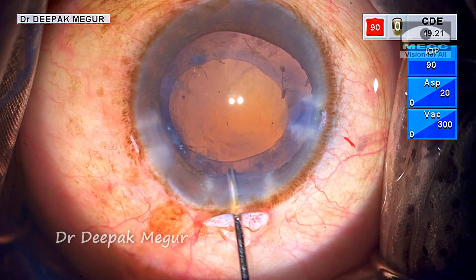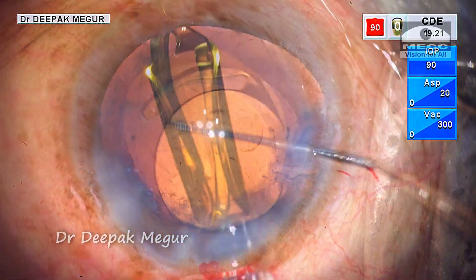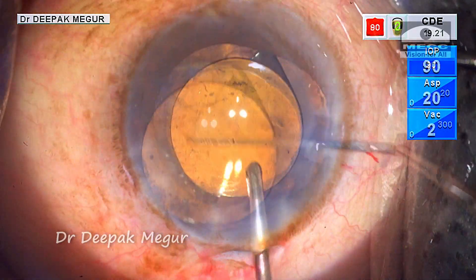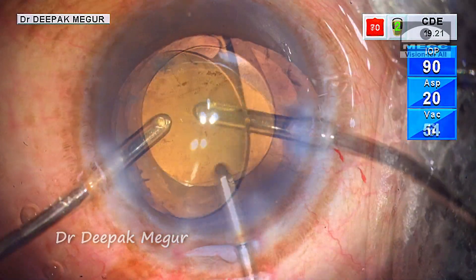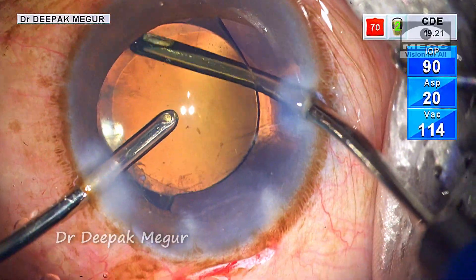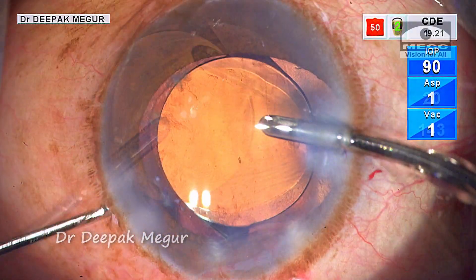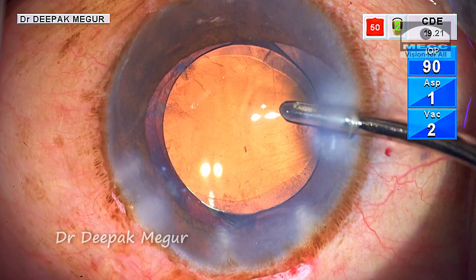Time to implant the lens. The bag is filled with OVD and the lens is implanted into it. As the OVD is being removed, the pressure reappears and the anterior chamber begins to shallow again.